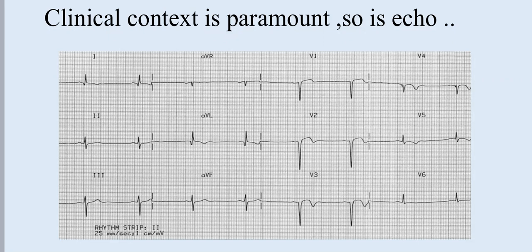Otherwise, you would have dealt with this patient as an acute STEMI, even late, you might have activated the cath lab. So you have to know. And here are the scenarios or conditions when you have to enlist other imaging modalities. If you are confused about these things, we encourage people to use the echo, because the moment you put the probe, you will see a diffuse scarring of the myocardium, thinning out, and a clear aneurysmal configuration of the apex, and that's it. You don't have to go any further, okay? Though the ECG is so alarming, the echo tells you that this is all longstanding ischemic remodeling. You don't have to do anything about it.